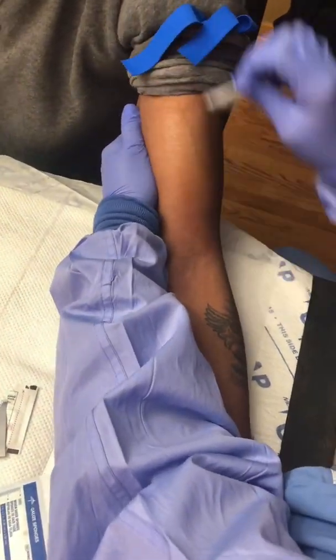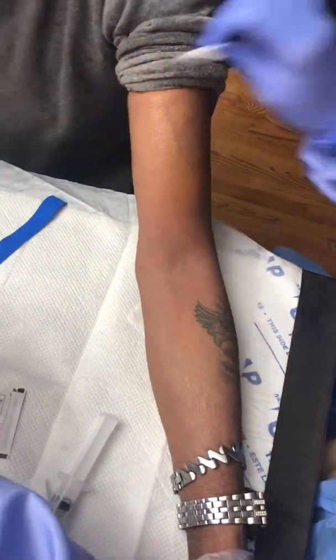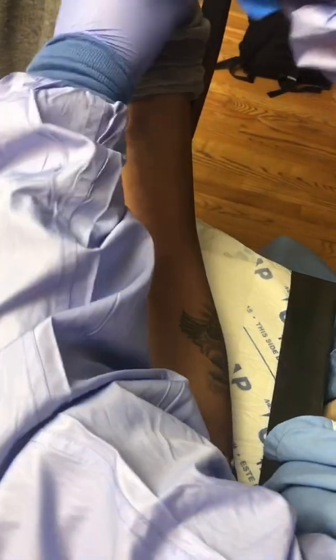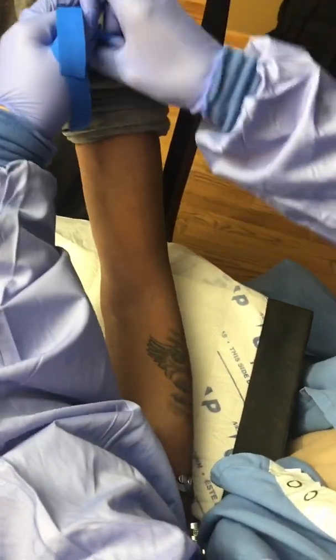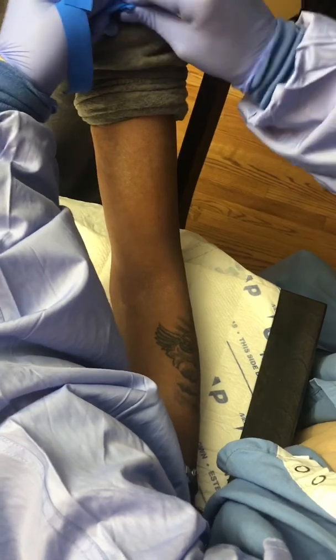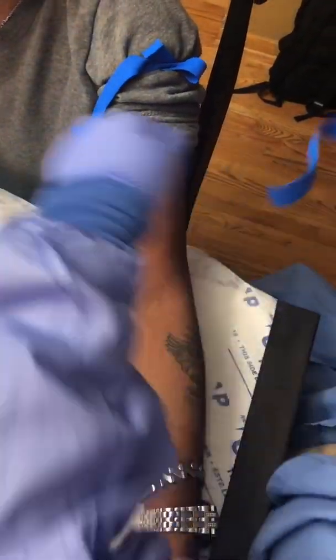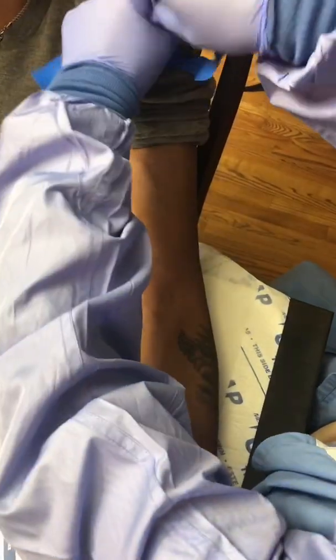Clean the skin with an alcohol wipe using good friction and allow the area to completely dry before you insert the needle. I always recommend giving frequent breaks from the tourniquet by removing it and then reapplying it after a few seconds. Instead of one really tight tourniquet, I like to use two tourniquets that I put on moderately tight.